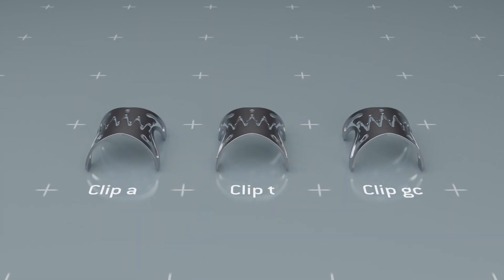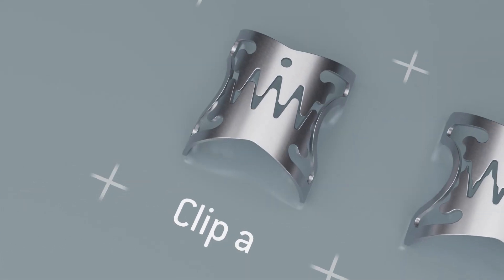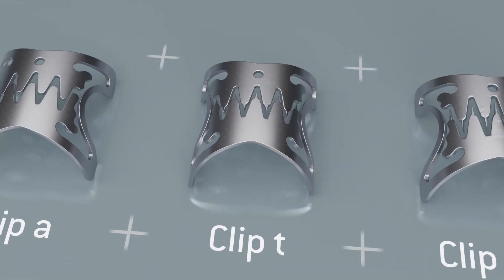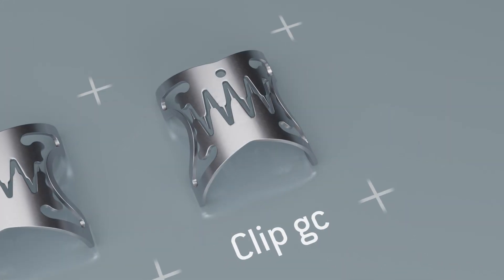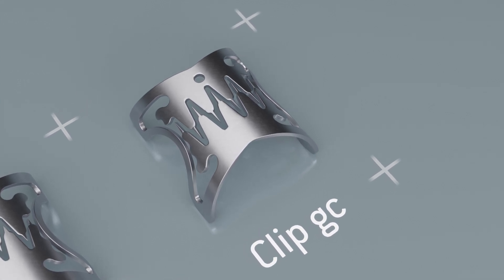There are three different versions of the OTSC Neo clip: Type A with blunt teeth, Type T with pointed teeth, and Type GC with longer pointed teeth specifically for the treatment of perforations and lesions in the stomach.